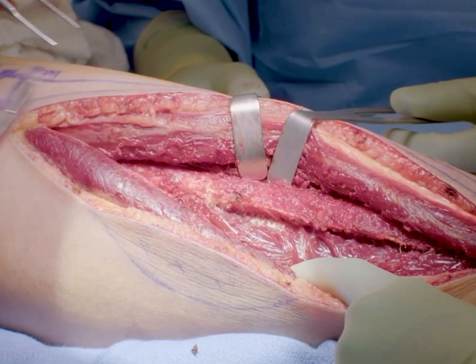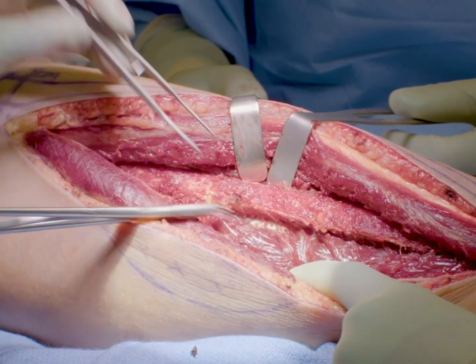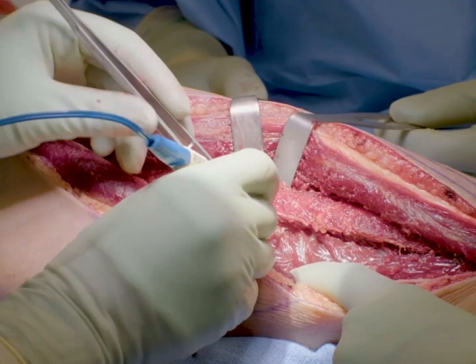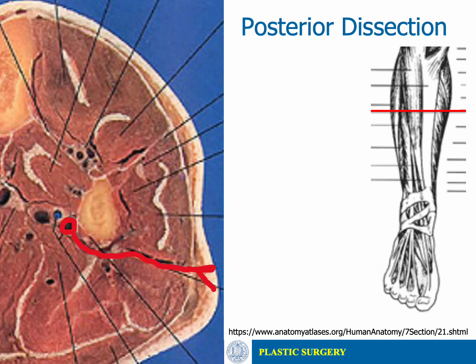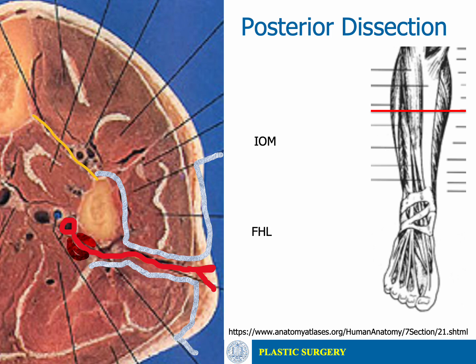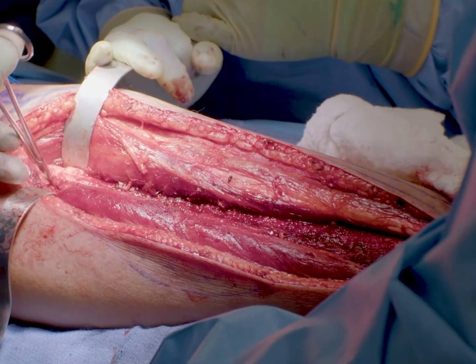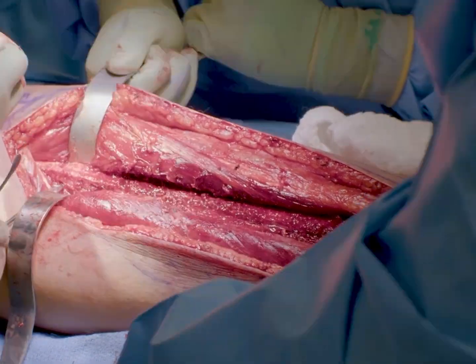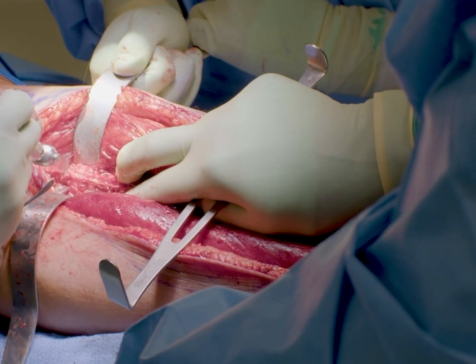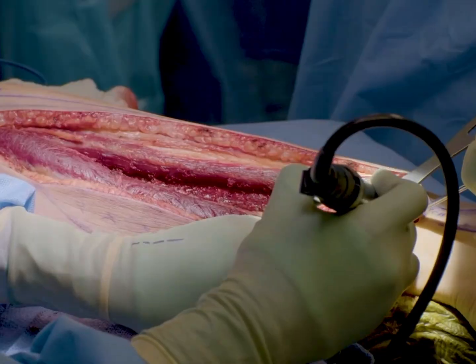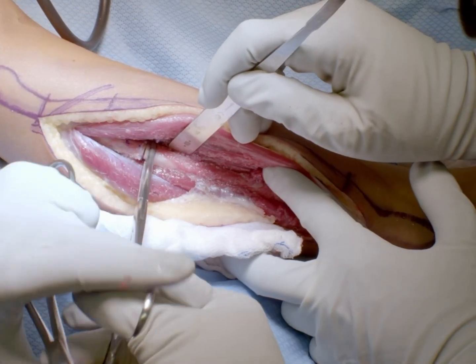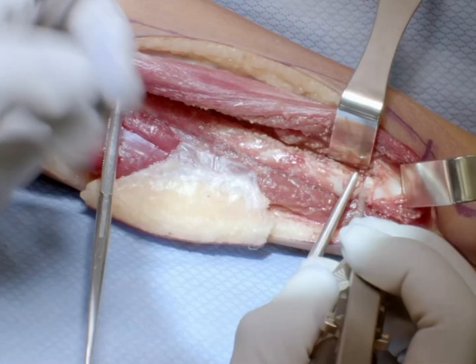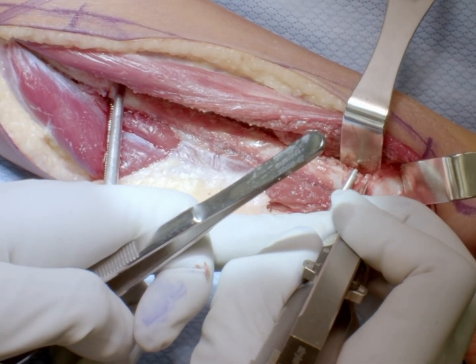Next, the soleus muscle is separated from the fibula while a small cuff of muscle is left on the fibula to avoid damage to the periosteum. Care is taken to manage the large perforators to the gastrocnemius muscle during this portion of the dissection. The dissection should result in exposure of the interosseous membrane anteriorly, and posteriorly we should see the flexor hallucis longus. The osteotomies are then performed. A right angle retractor or Hohmann is placed at the distal and proximal osteotomy sites, and care is taken to prevent transection of the artery just deep to the bone. Clamps are used to aid rotational control, and a small wedge of bone is removed distally to expand the working space.